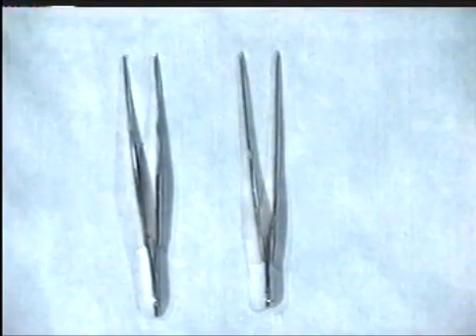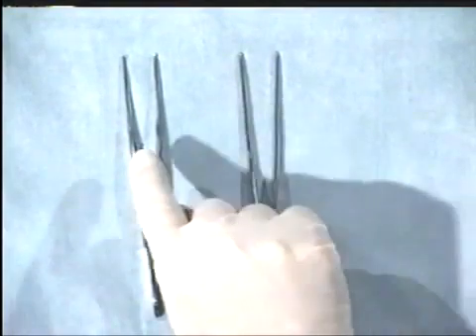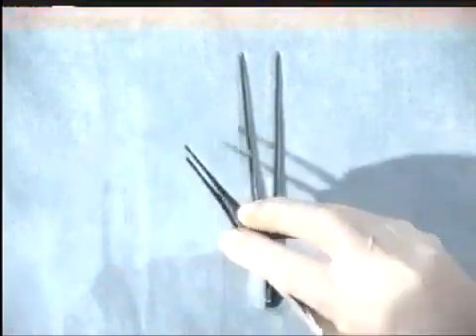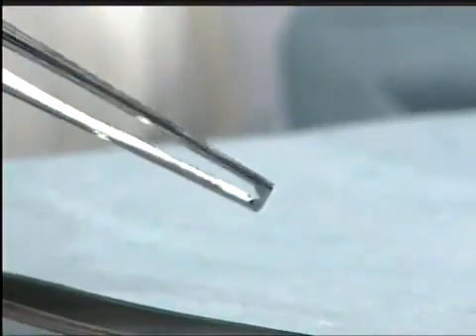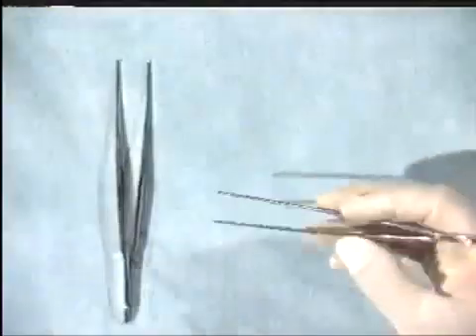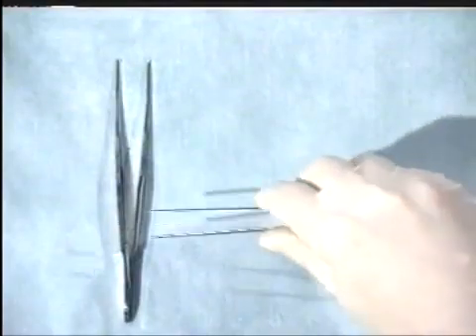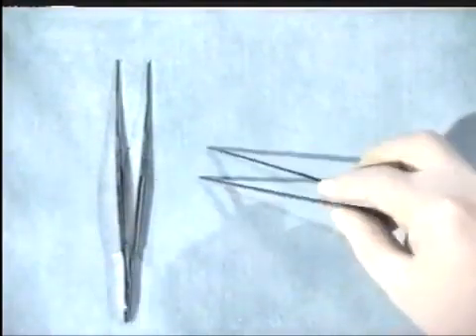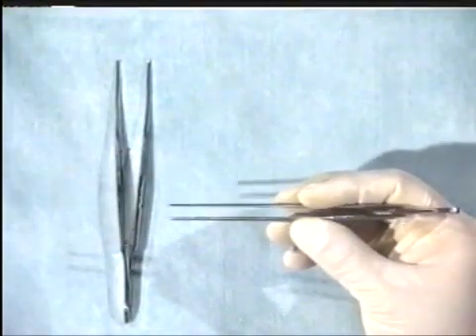We now move on to the forceps. There are two basic types: the non-toothed and the toothed. The toothed forceps are often used for tough tissues such as skin, while the non-toothed forceps tend to be used for more delicate tissues such as bowel. Hold the forceps as demonstrated, and not grasped in your fist. By holding them gently, you get accurate control of the tips of the forceps.